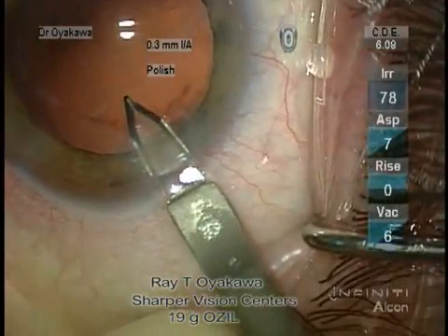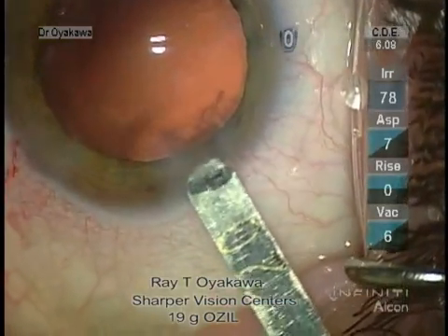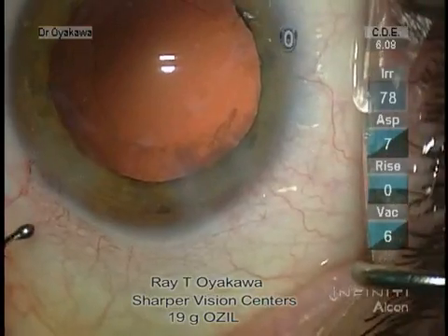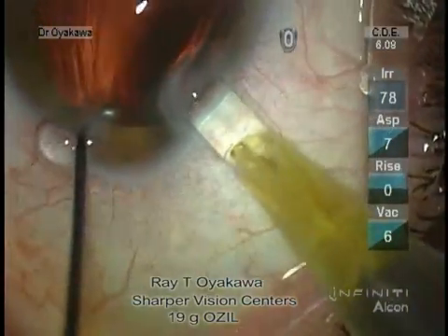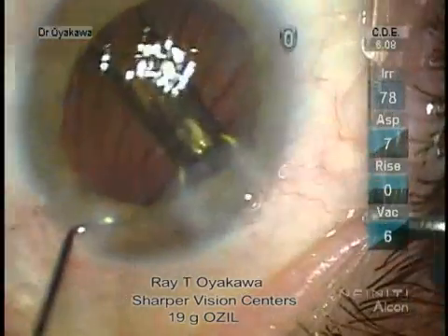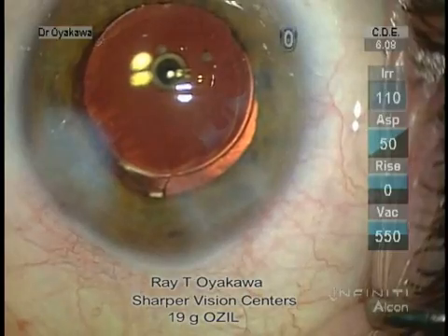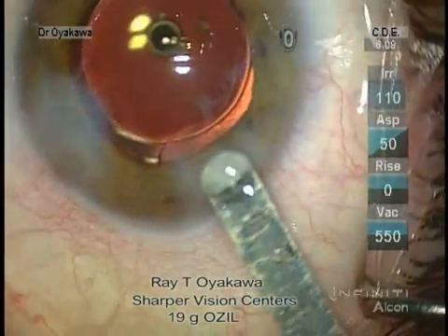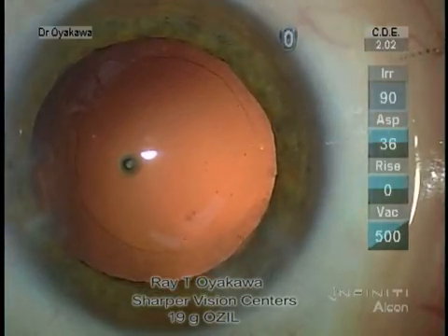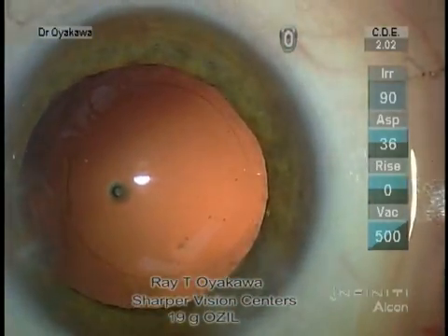We're going to enlarge the wound again. It's about 1.9. The wound after insertion was about 1.9. Here I'm using a metal keratome — I believe it was a 1.9 keratome. This is just a shade under 2.